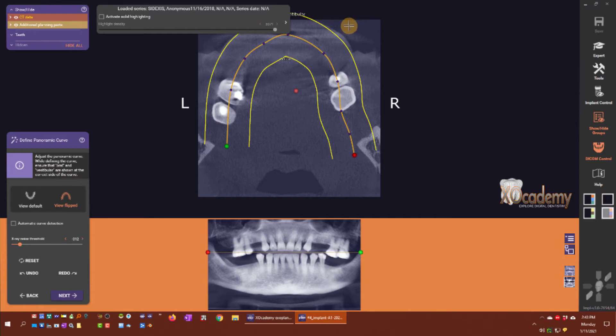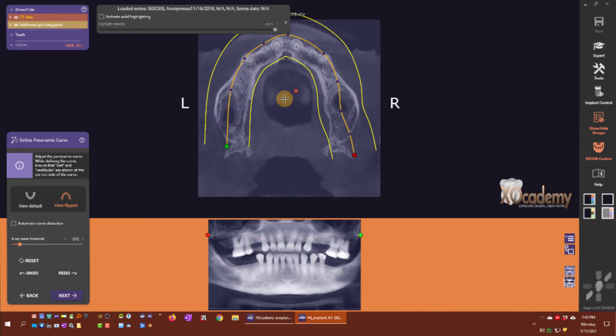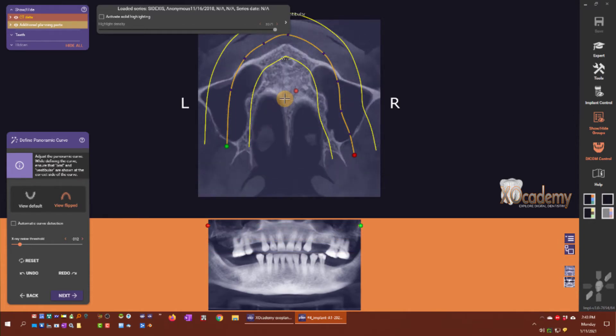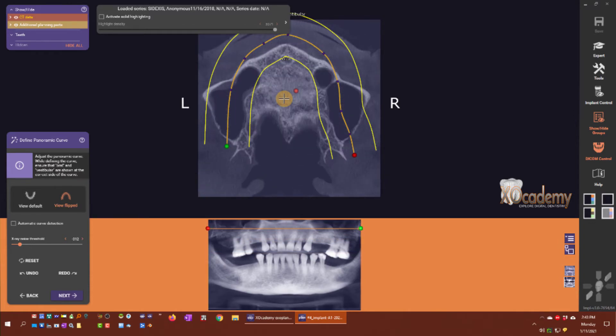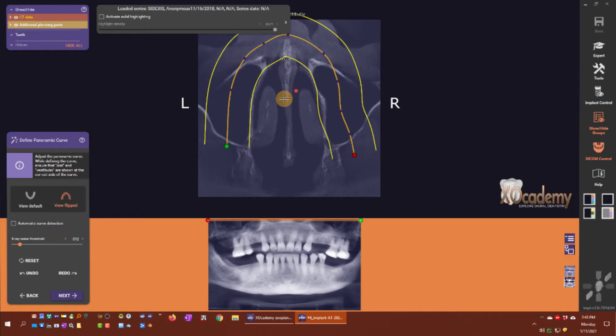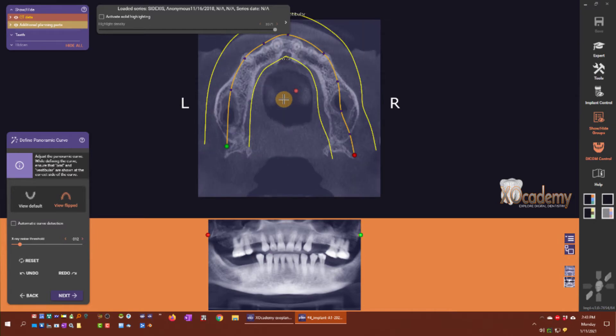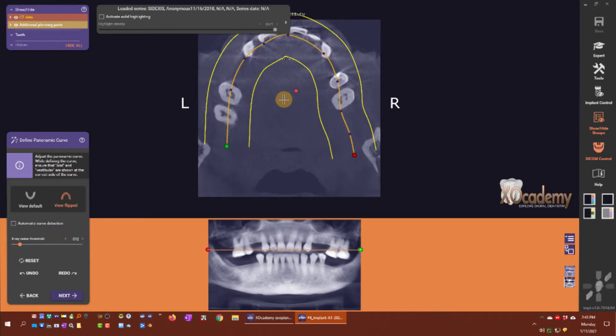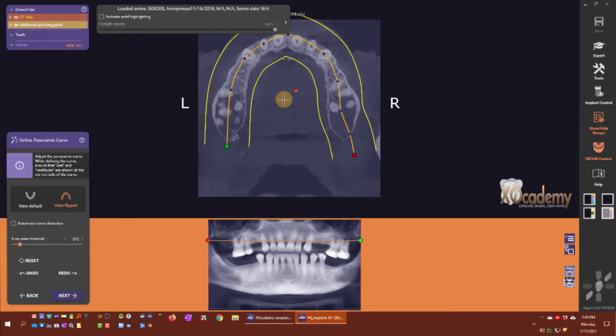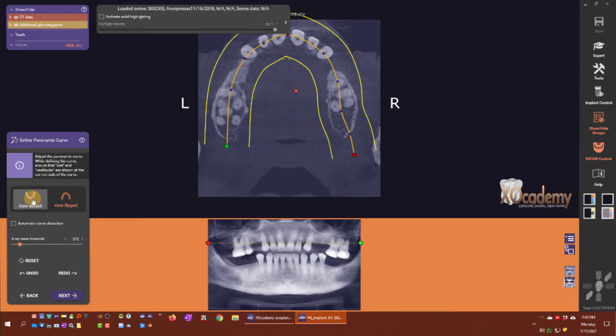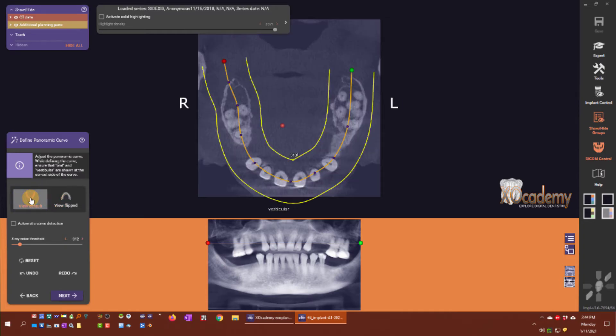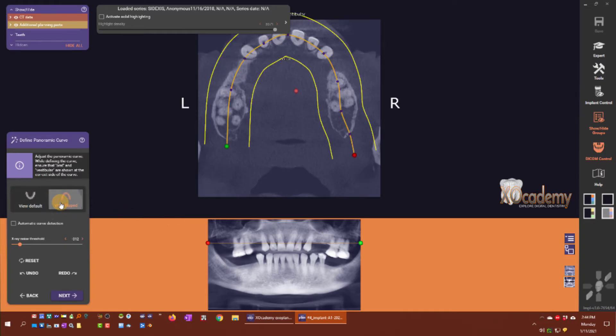The default view, you can just keep this view default there. That's what the view flipped button does.